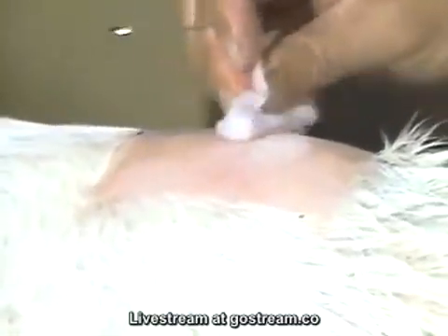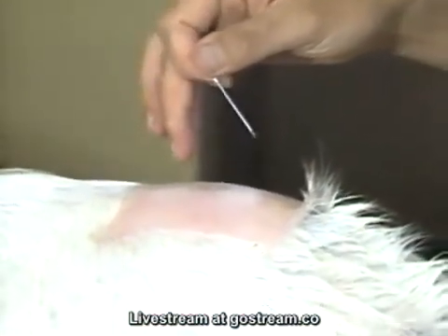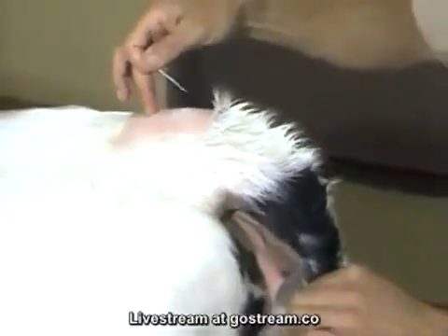The area is prepped with alcohol. Take an 18-gauge, preferably a 1½-inch needle — it could be done with a 1-inch needle. Then it's helpful to identify the site one more time with a finger.